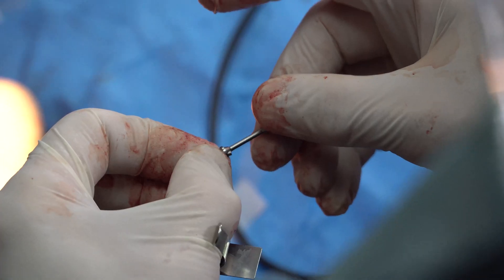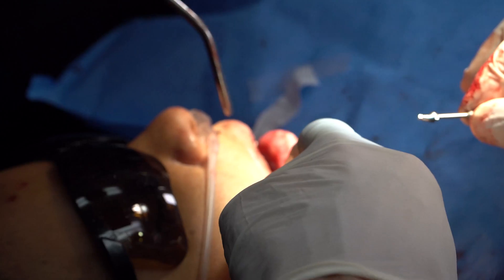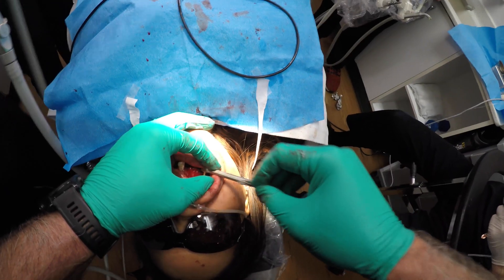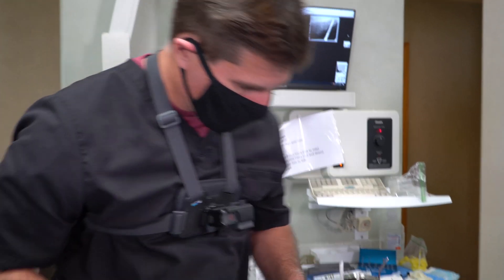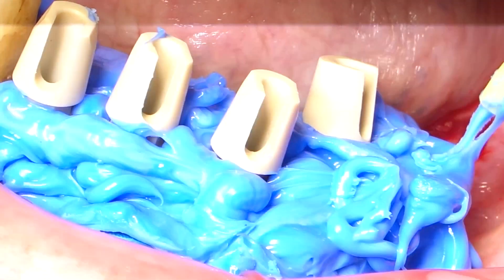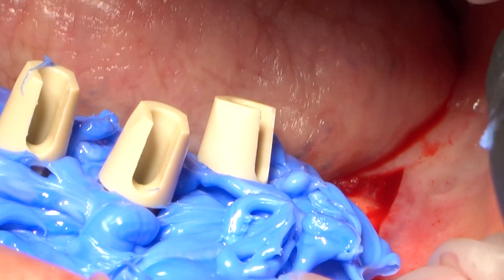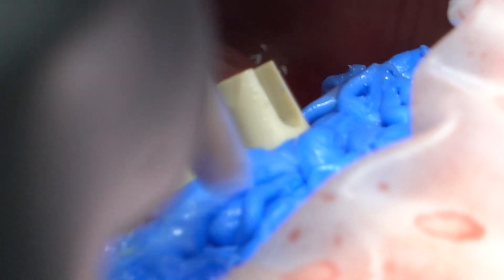We placed six implants. The literature shows pretty clearly that you can't scan implant position with an intraoral scanner accurately, part of the reason having to do with the color and the blood and the open wound. So we use our scan dye material to be able to track with our scanner. Once it hardens, it stays nice and rigid. So we wash it, dry it, and get it ready for a nice scan.